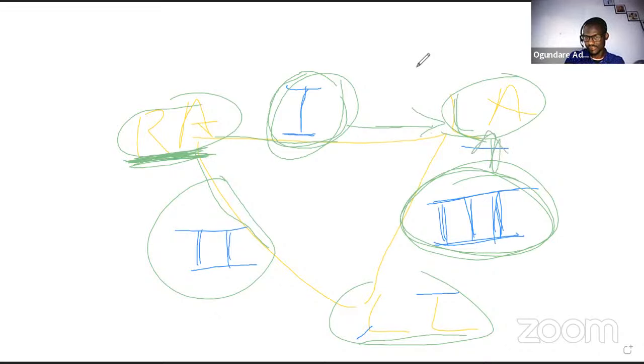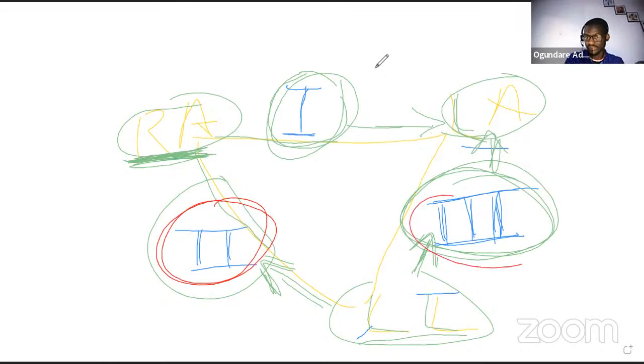And obviously the electrode on the left leg produces lead 3 and lead 2. So if the abnormal ECG waveform, the artifact, is peculiar to lead 2 and lead 3 alone, then you know that you need to adjust the electrode on your patient's left leg. Okay, so that is how to apply the understanding of the Einthoven's triangle.